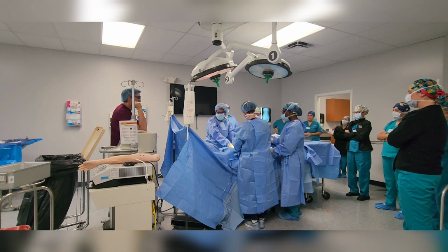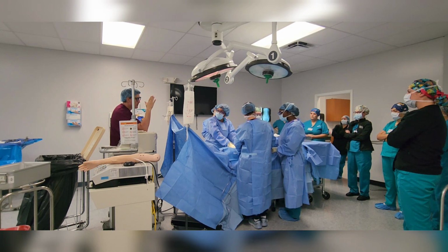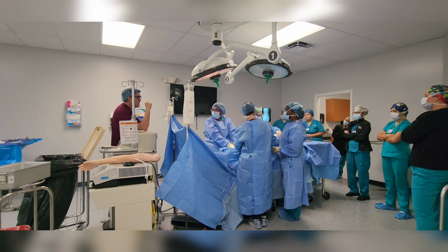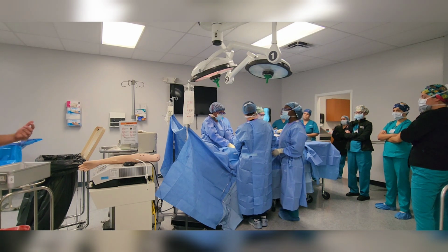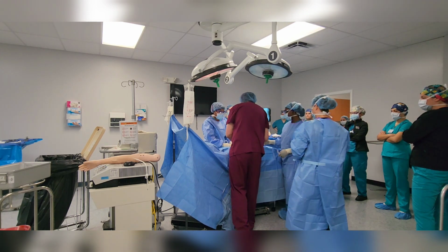Go ahead and I like to do what I call a speed test. And we're going to rotate out here real quick. So, whatever's on your mayo, take a quick glance, Brooke. And then quickly, the doctor is just going to constantly ask for it. This was what someone showed me before, and it's a good example, it's fun also. So you can take those off.